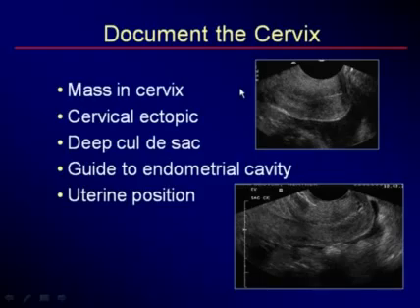So now that we've quickly analyzed the position of the bladder and the appearance of the bladder, we now move to the cervix. You should look at the cervix separately and directly. You want to be perpendicular to the uterus. You want to leave the rest of the endometrium and the fundus and the corpus out of your picture, 90 degrees to your area of interest.